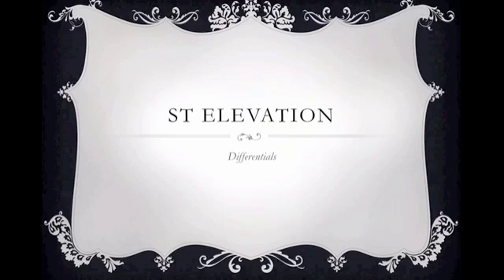So we are going to go over some of the differentials of ST segment elevation so we can close the gap between ER physician and medic, and that's pretty much the point of us further learning, so we can become better clinicians when we're on scene and we're reading these 12 leads.